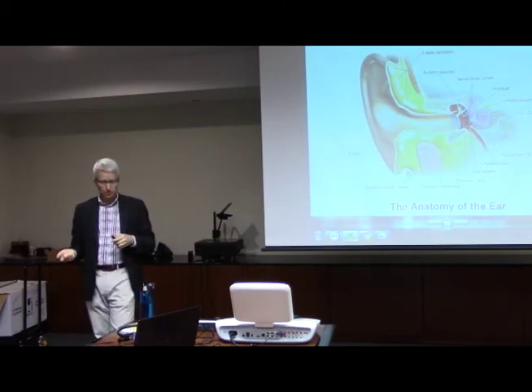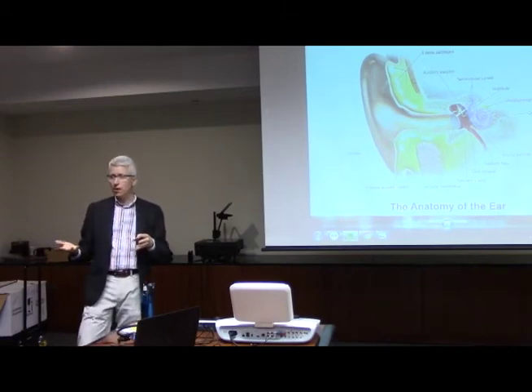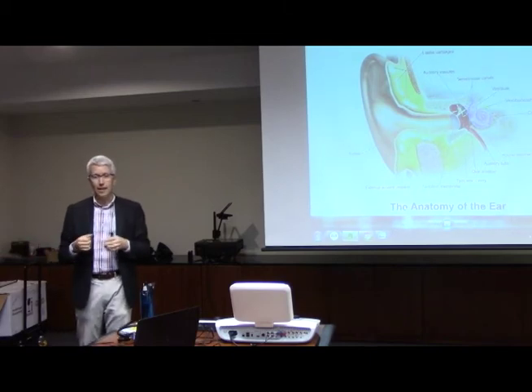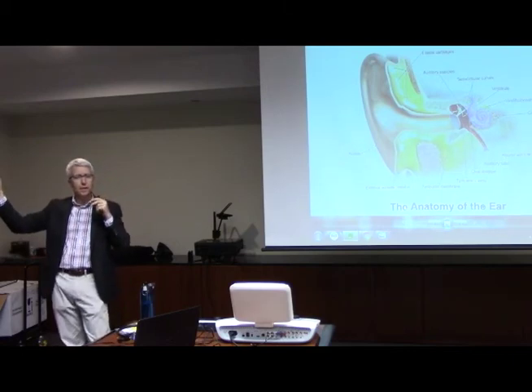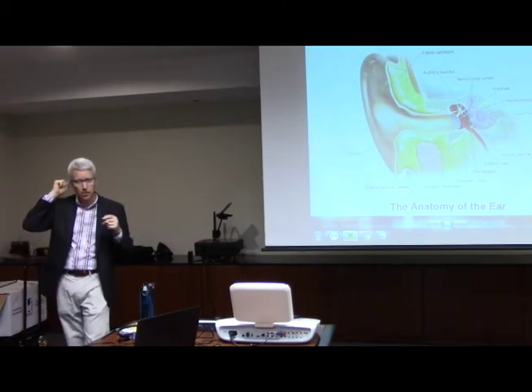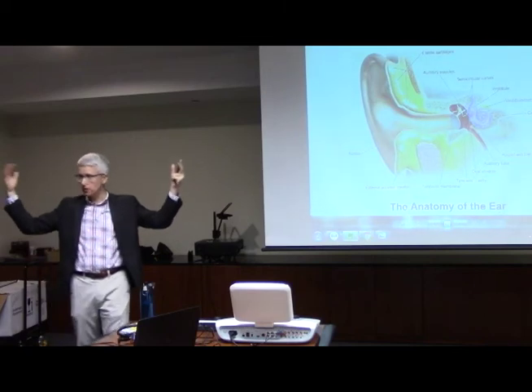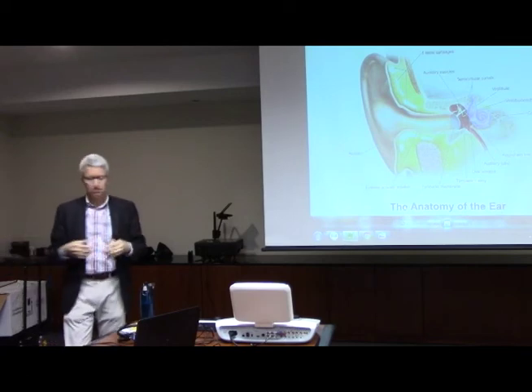So that's visual reinforcement. Conditioned play is something similar, but this is for a slightly older child who is going to really quickly get bored and say, yeah, I heard it, yeah, it's a toy, nope, don't care. Around 3 years old, you start to get into that, and what you do is every time you present a tone, either through headphones or through the speakers, you make it a game. You give them a block. Throw the block in the bucket when you hear the tone, and you train them on this. So every time they hear the tone, they throw the block in the bucket. Quite often we'll do that through the speakers, which is the purpose of the speakers that we sell, install and calibrate.